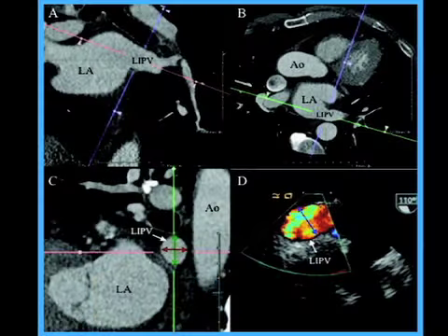We did specific imaging of the left atrial appendage and pulmonary veins, trying to measure dimensions, and similarly by CT we assessed en-face views of the pulmonary veins. For stenosis, we calculated a percent area reduction. The first illustration shows how we measure the pulmonary veins both by CT and TEE. As you can see, the veins by CT are elliptical in nature with a major axis and a minor axis. Similarly by TEE, you can see the ostium of the pulmonary vein measured at 110 degrees.